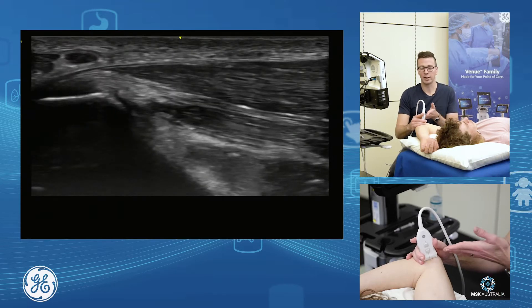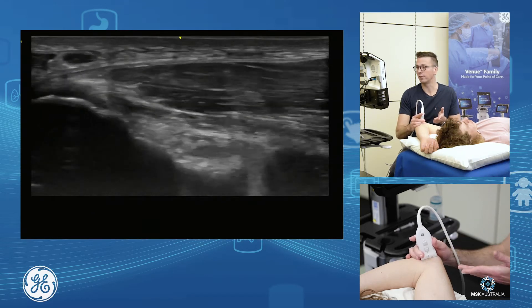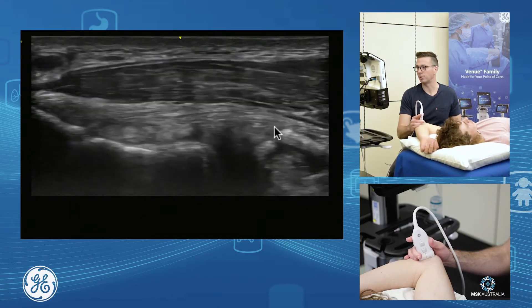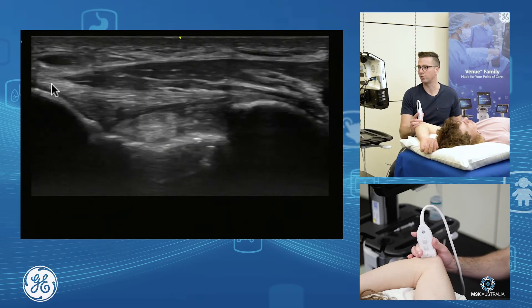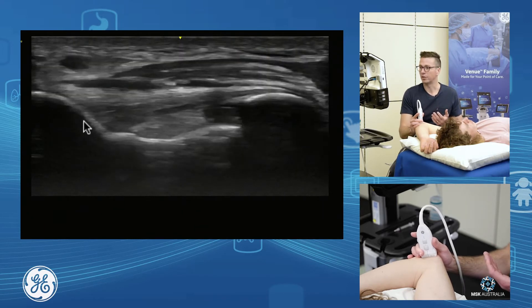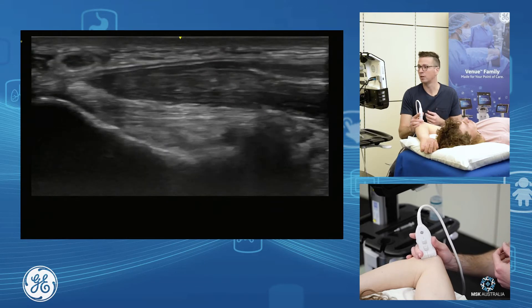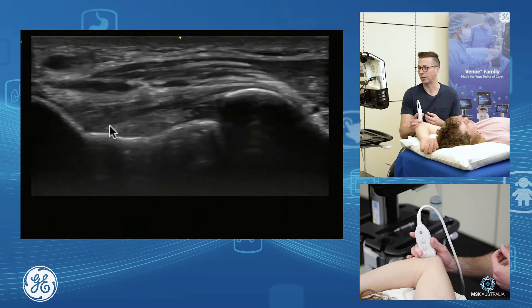From here, if I keep this end of my probe anchored and rotate the end towards the patient's little finger, I then come down more towards the ulnar collateral ligament — the anterior band. We can see the anterior band of our ulnar collateral ligament here as this fan or sail-shaped apparatus inserting onto the sublime tubercle. Probe towards the patient's little finger, probe towards the patient's thumb — common flexor, ulnar collateral ligament, and the underlying joint.